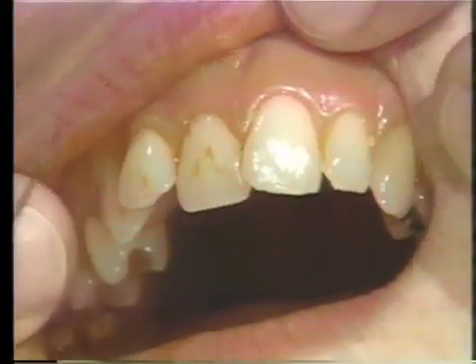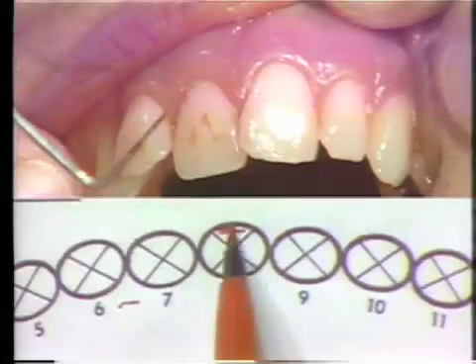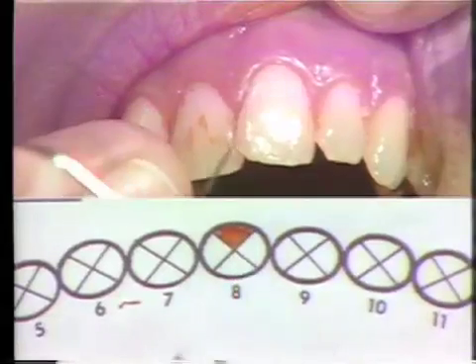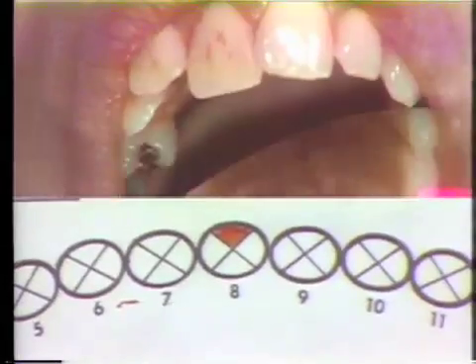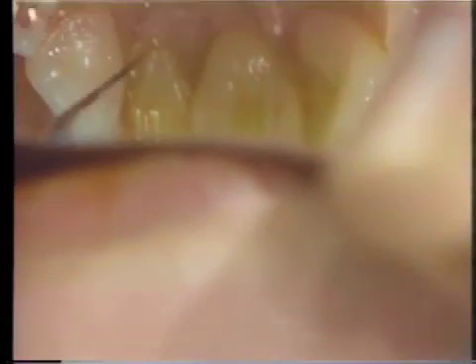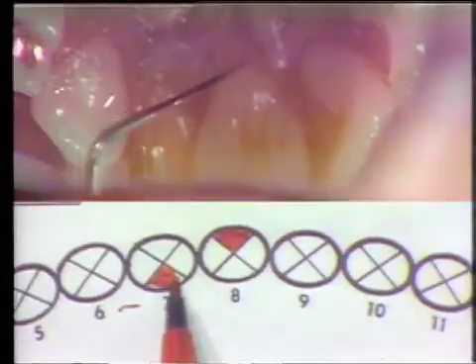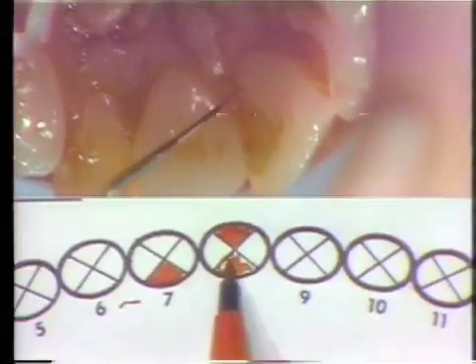We notice that on tooth number 7, there is no plaque in this area. On tooth number 8, we have plaque in this area, so I would fill in the quadrant on the chart. On tooth number 9, there is no plaque in this area. Moving to the lingual, I would record the plaque scores in the same manner. The plaque on the lingual is located on number 7, right around the gingival margin on the lingual of number 8, and at the gingival margin on the lingual of number 9.